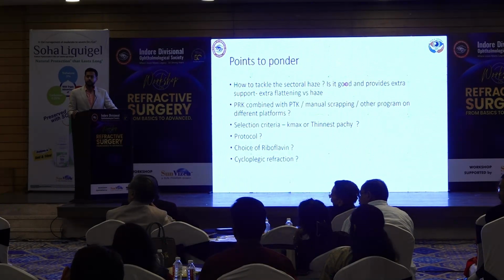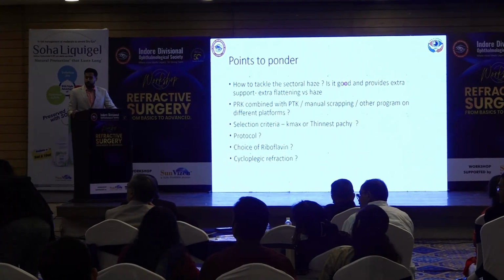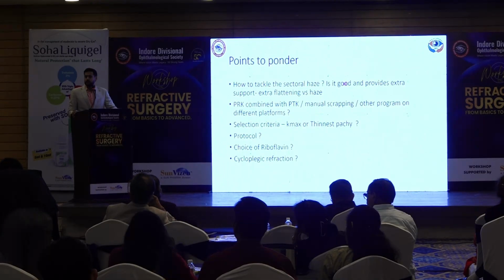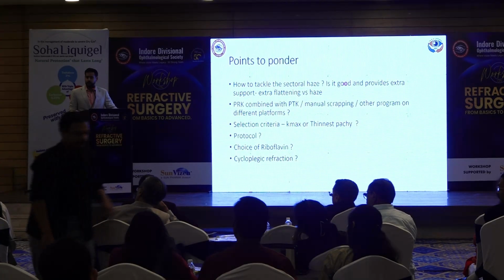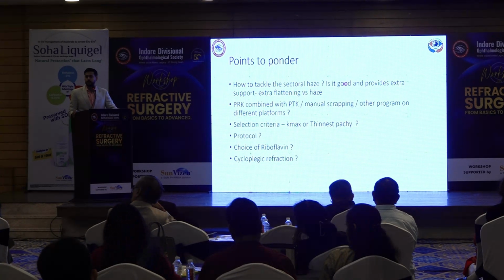In 12 years, we do close to 1,500 cross-linkings a year. And I have never done only cross-linking. Everything is a combined one, because the mindset of lasers on keratoconus is an outdated one. It is called a controlled scarring. You're creating a balanced scarring, which is giving you a combined effect of cross-linking on that area. So what you're doing is right.